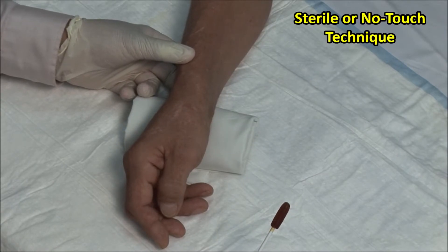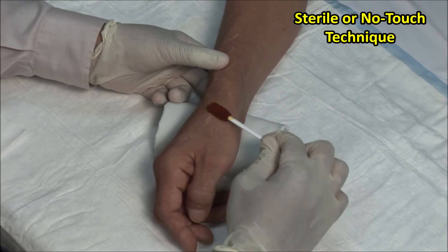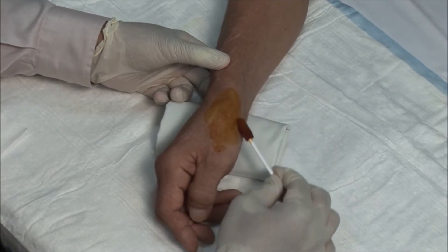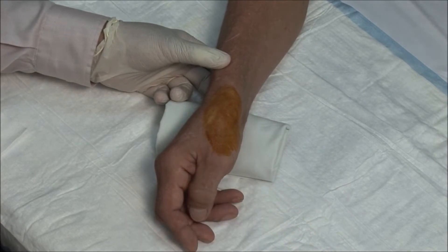A no-touch technique is used, meaning that once the area is cleaned, it must not be touched with anything but sterile needles. Scrub the site and then clean in an outward fashion. Here I am using betadine followed by isopropyl alcohol.